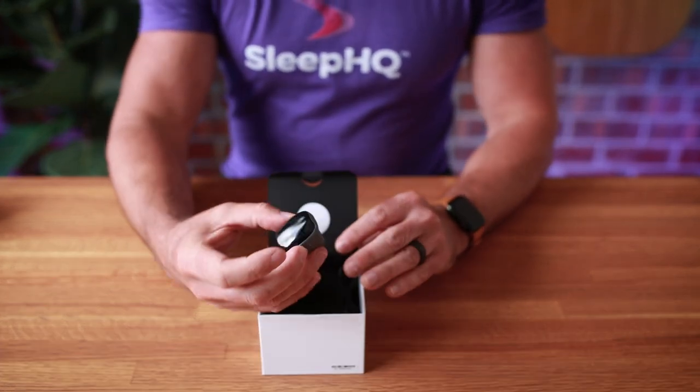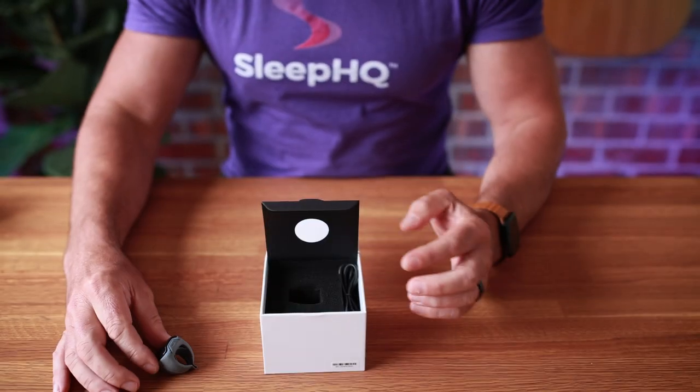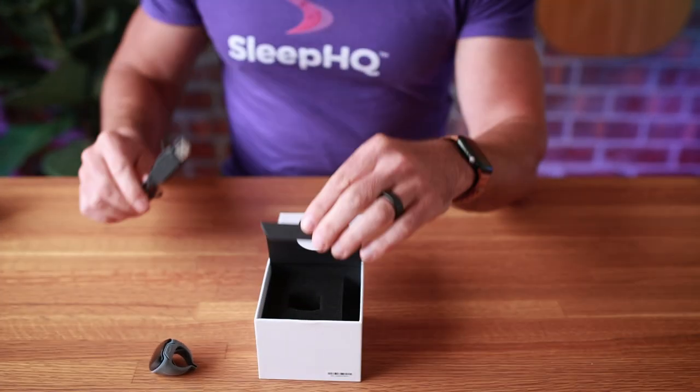Inside the box we have our O2 ring and also our USB charging cable.